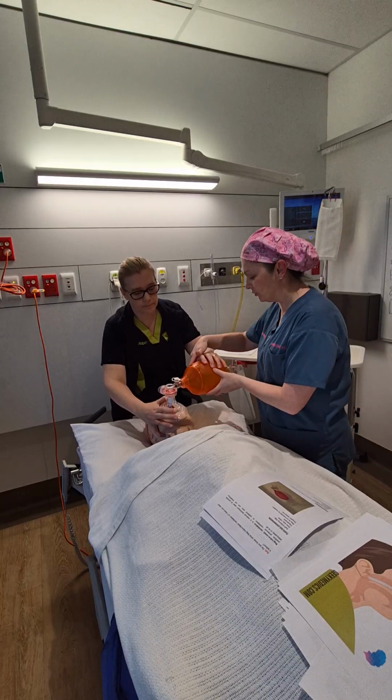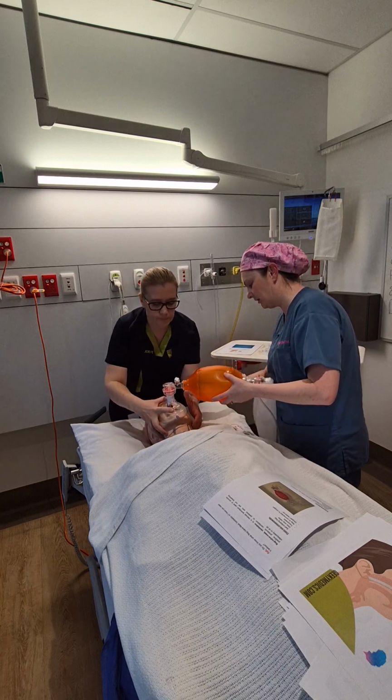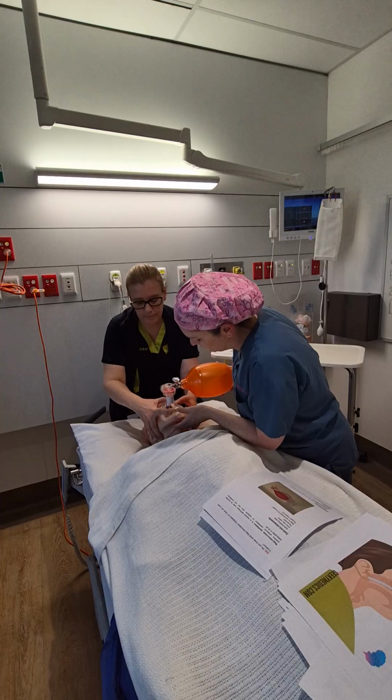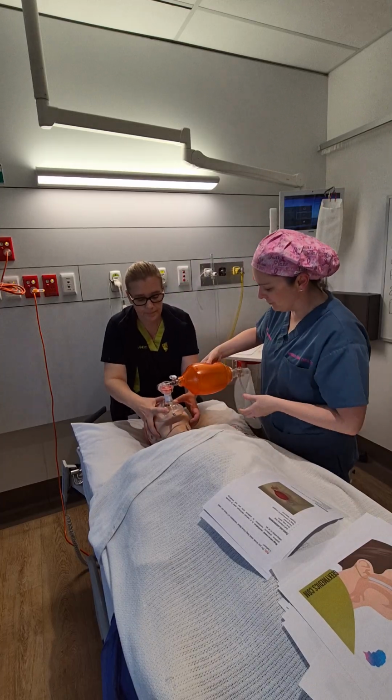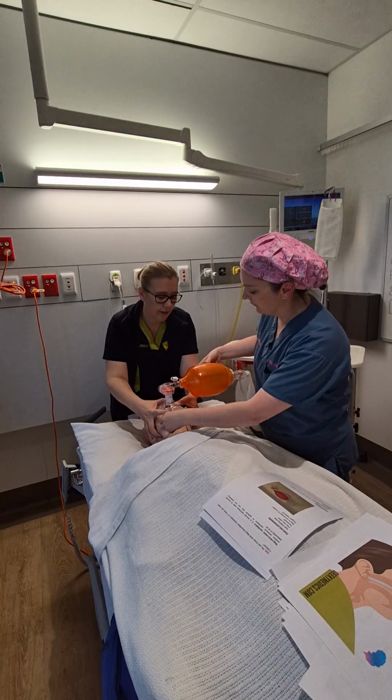So I'll get you to try the two-hand technique. So pop your fingers under there, thumbs on the top there. Do big jaw support. Wonderful. And then you can also feel if there's any leak, you'll be able to feel it on your hands.